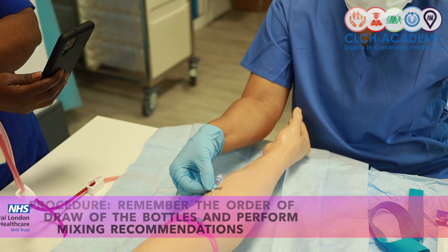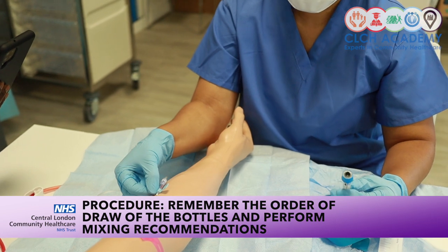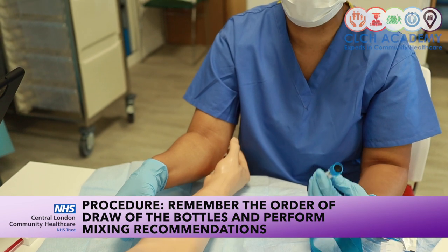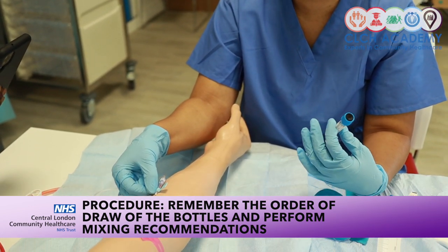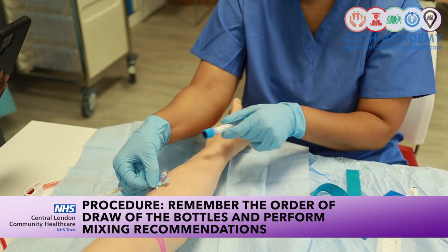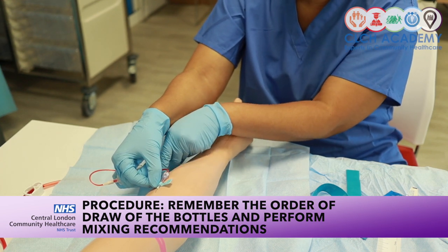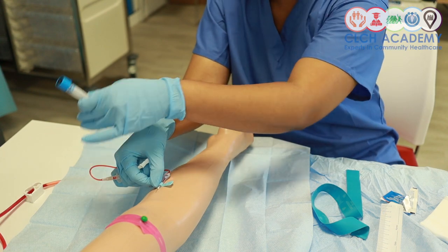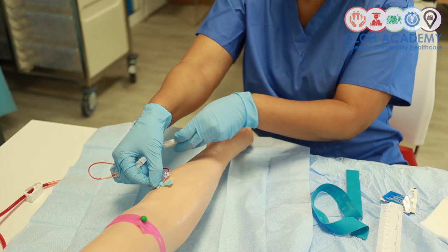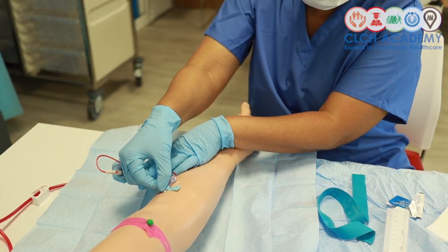Now, order of draw, if we were collecting a clotting sample, first is to start off with a clotting bottle. I always say, obviously, because there's dead space in the line of the butterfly, it's quite useful to get rid of the dead space so that it doesn't displace my volume when it comes to filling up that clotting bottle, and I get the exact amount I need for pathology to analyze. So I use my initial bottle to prime the line. That's just to get the blood to the point of access. And then my second bottle is actually my collection bottle. And I will fill that to the recommended amount.